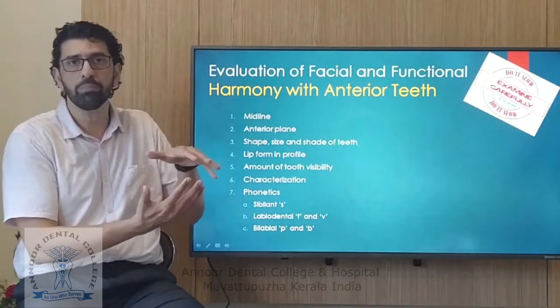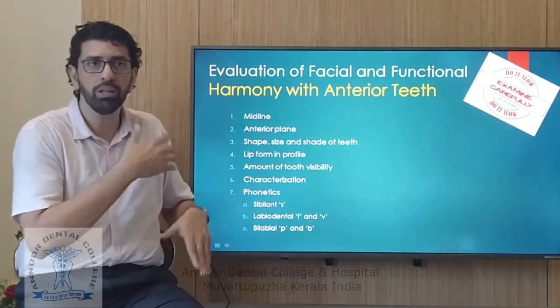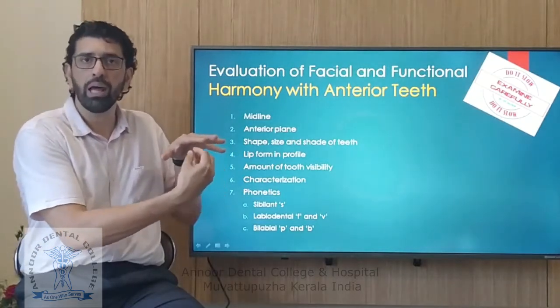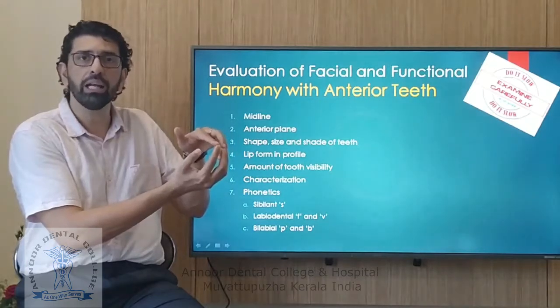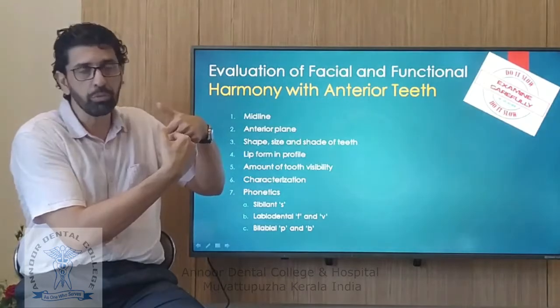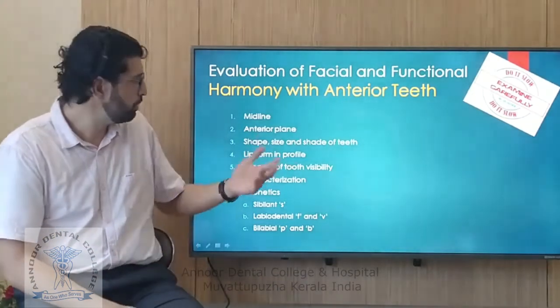If it's well supported, you will find that the mucocutaneous border is up and the wet line is seen. That is how it should be. The contact should be between the wet line to wet line and not the mucocutaneous junction to mucocutaneous junction. So if it's unsupported, you probably have that look, and so it's important that it is well supported.